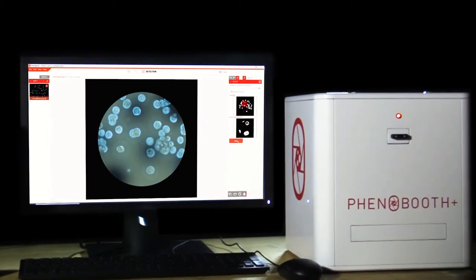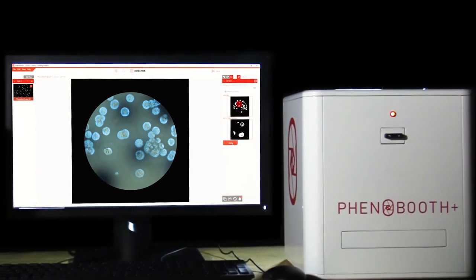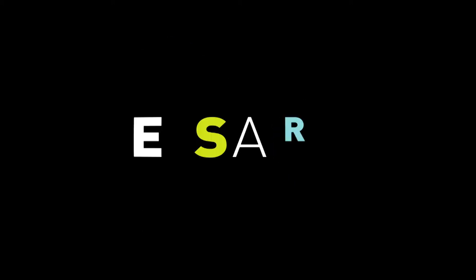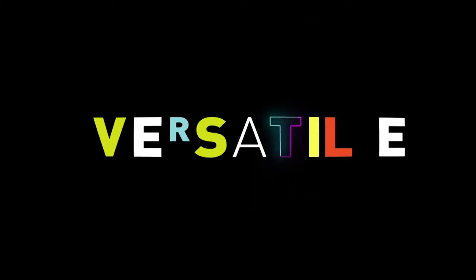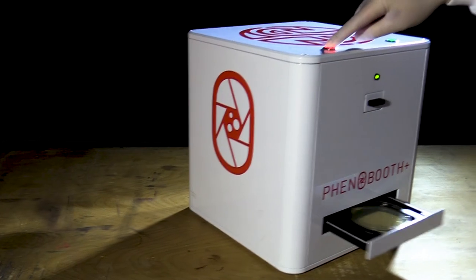Phenobooth Plus — it's just a colony counter. High resolution, versatile, time saving, easy imaging.